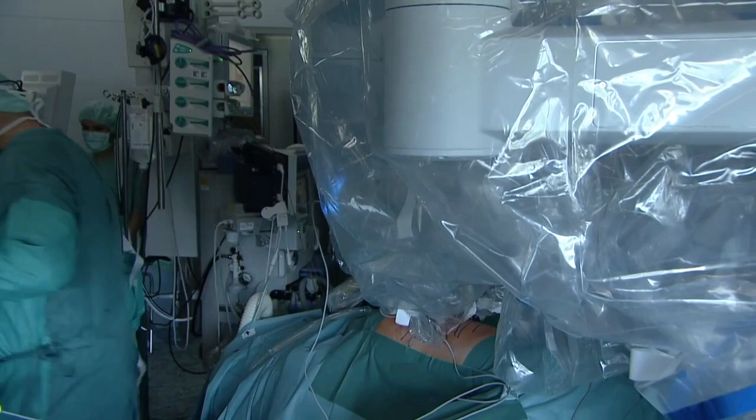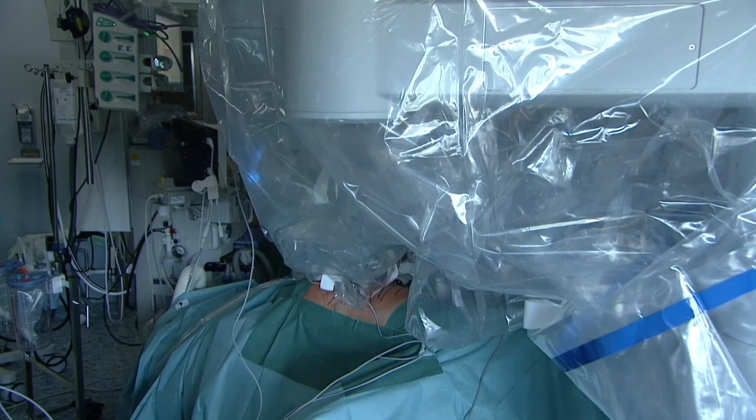And for the lens, when you go transperitoneal, you also have the 0-degree lens? Yes. All right, so now we're going to start.